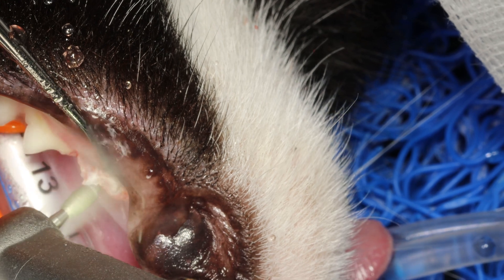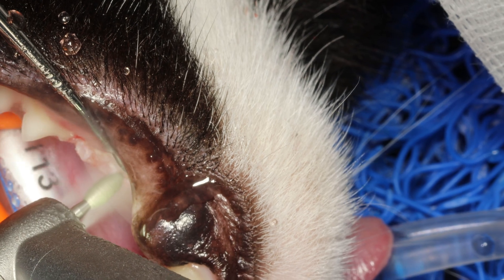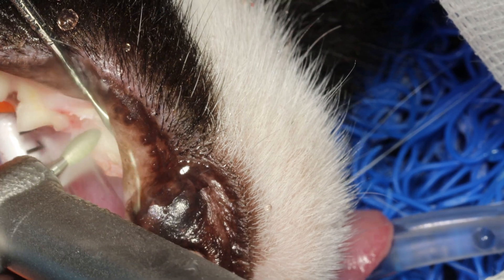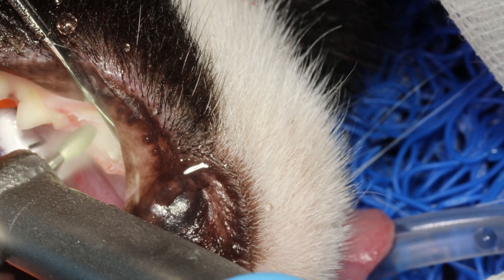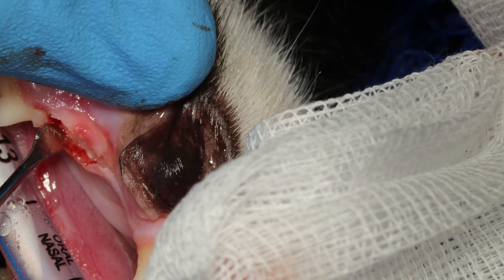Basically I am just going to remove all remnants of the crown, because these roots have already been almost completely resorbed and turned into bone. All I have to do is get rid of that inflamed crown that is protruding through the gingiva and causing a lot of pain and inflammation.